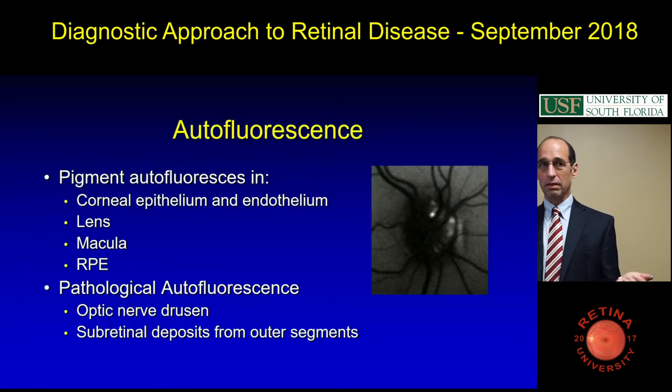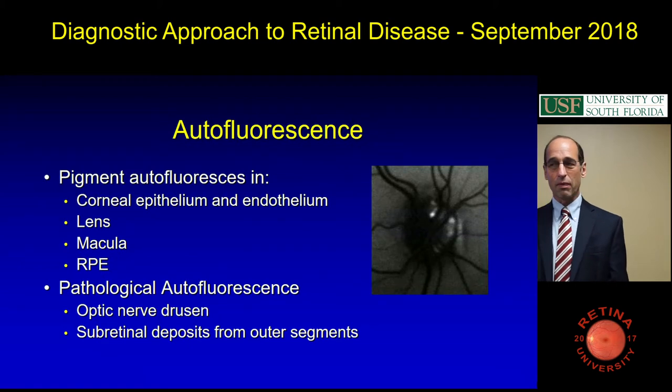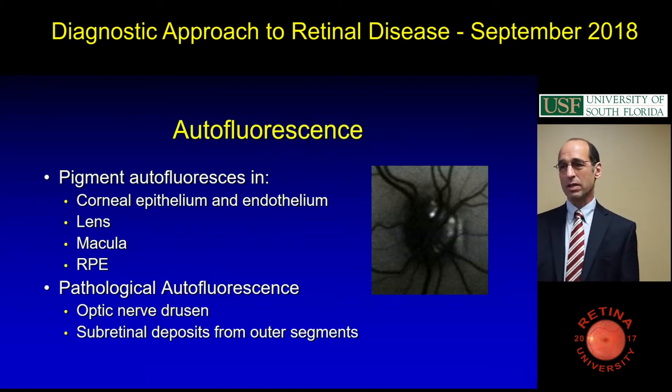So that's infrared. It's interesting to know just because you always get it. People bring them to conference and you're always going to get infrared on all your patients, so it's nice to be able to interpret it.